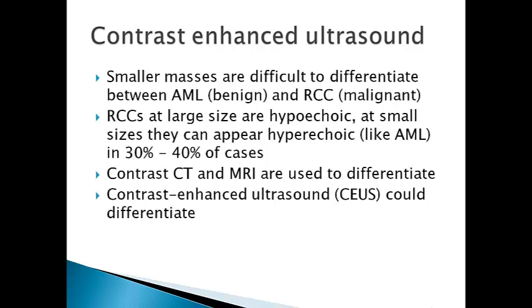So they were looking at using contrast-enhanced ultrasound to differentiate. Contrast-enhanced ultrasound is where the patient will take contrast, much the same as in other imaging modalities. However, the contrast used in ultrasound is less nephrotoxic, it has fewer side effects, and obviously ultrasound is much cheaper than CT or MRI and also less invasive for the patient.